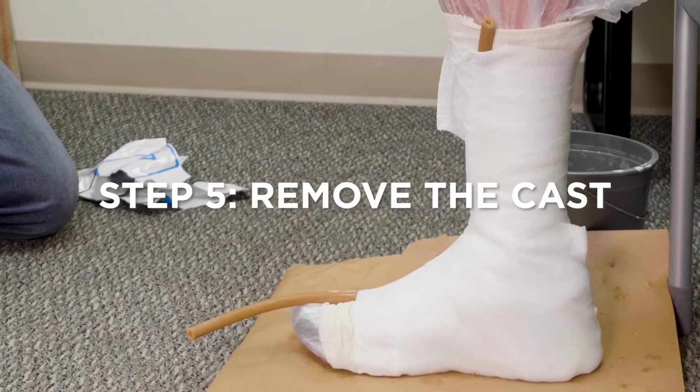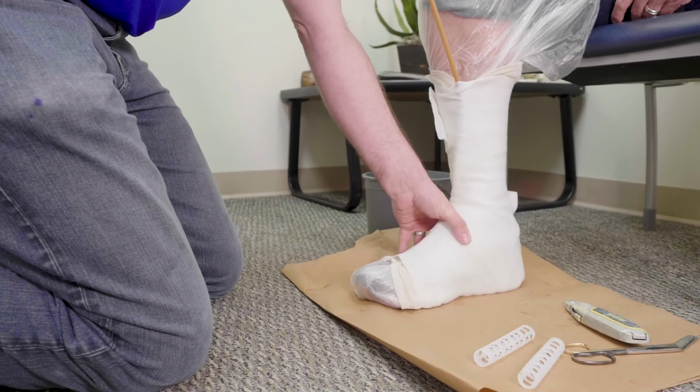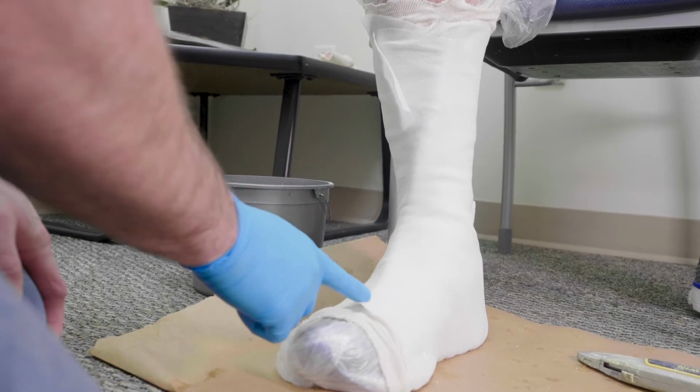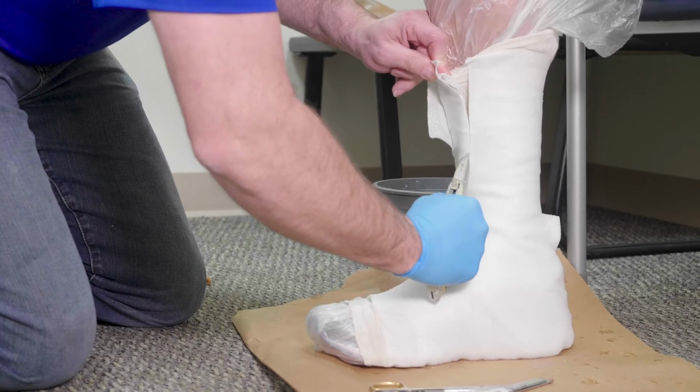Now that it's hardened, it's time to remove the cast. Grab the surgical tubing and pull to remove it from the cast. Notice a ridge has formed along the top of the cast. Using your cast knife or cast saw, cut along the ridge in the cast.